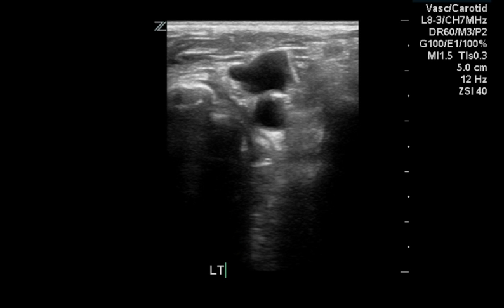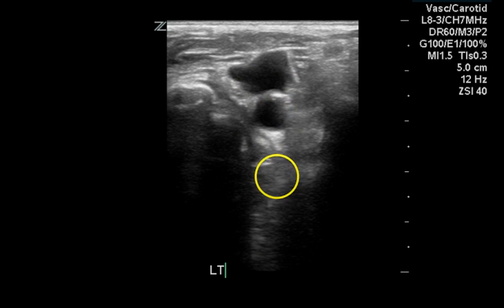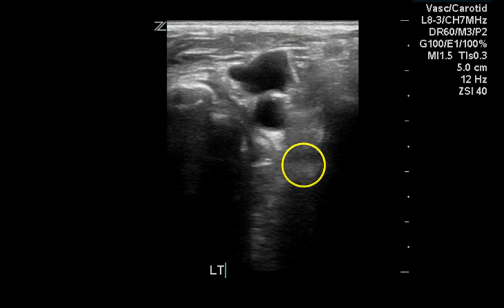This is a transverse image of what I'm assuming is the left common carotid artery. Again, we see some minimal thickening and an overlying jugular vein.